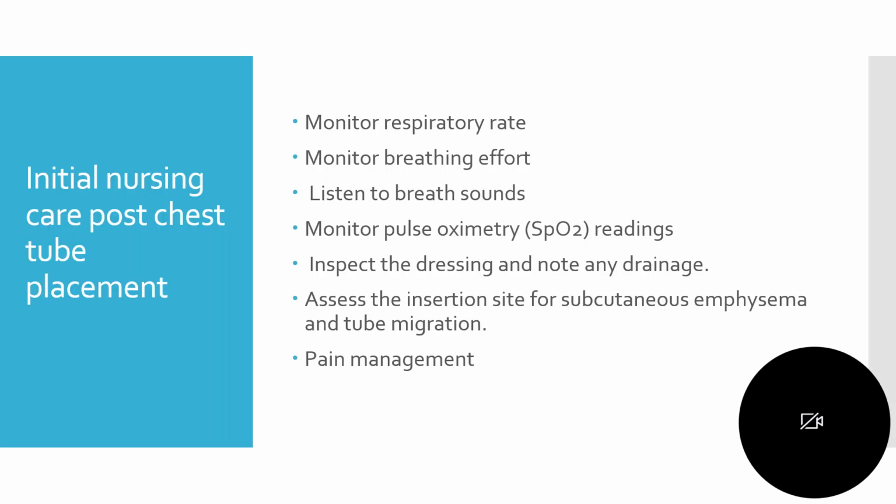Now, initial care for the patient that has had a chest tube inserted is obviously you're going to get vital signs, you're going to monitor respirations and breathing. Listen to lung sounds, that's very, very important. Check O2 sat, and always inspect the dressing and note if there's any drainage.